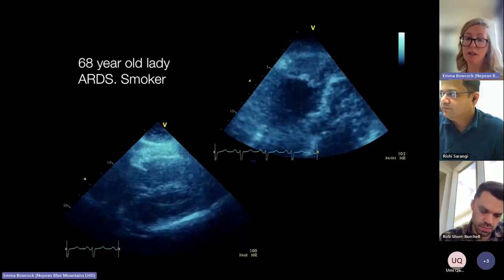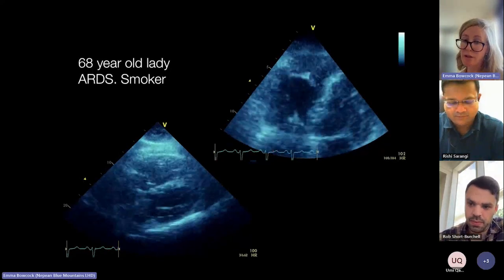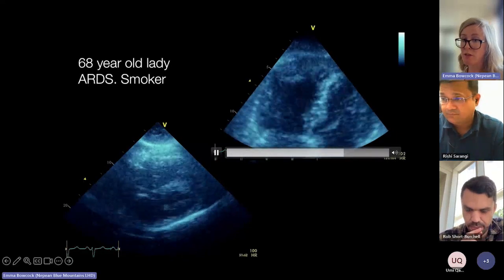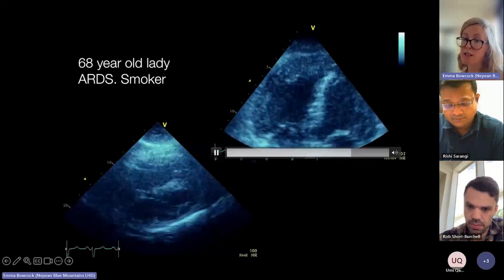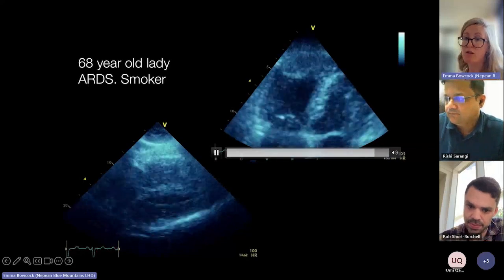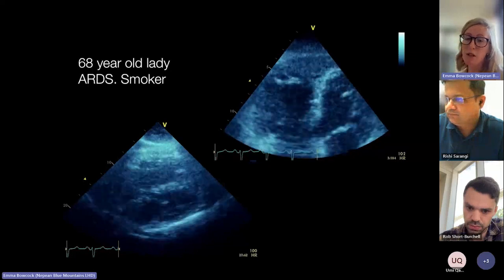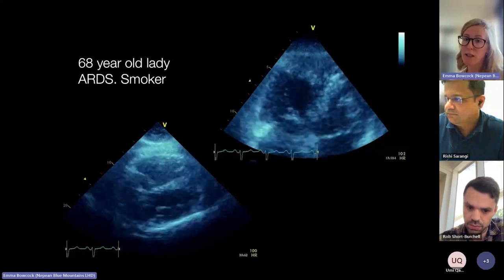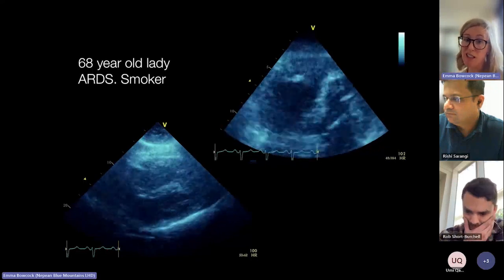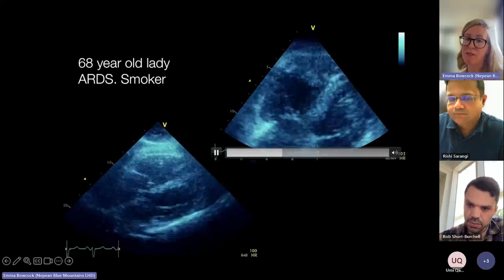It's being pulled. And so other things that I find really useful clinically is to look at the fractional area change if I can. And that's difficult. You can imagine trying to do the fractional area change on this, exactly where the endocardial border definition is and what's trabeculation and all of this. But the RV free wall strain I think can be helpful, but also looking at your RV S' or TVTI. And those are the things that I would be doing at the bedside. We can easily do these three things now with the machines that we have, and definitely not hanging my hat on a TAPSE here.